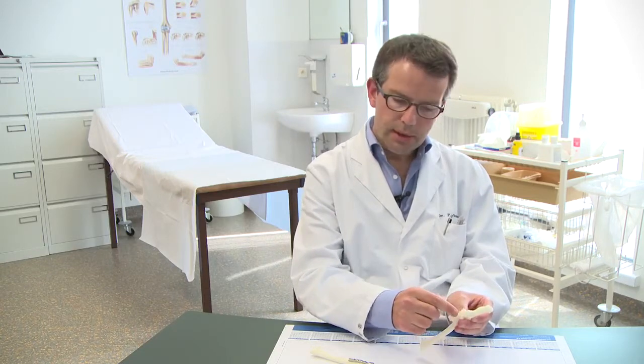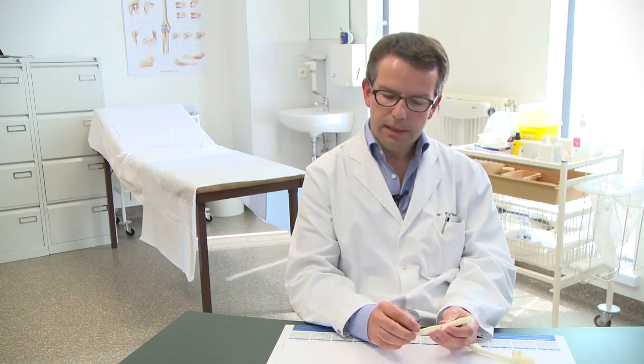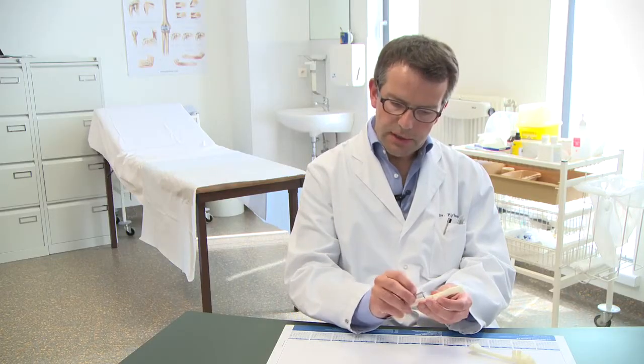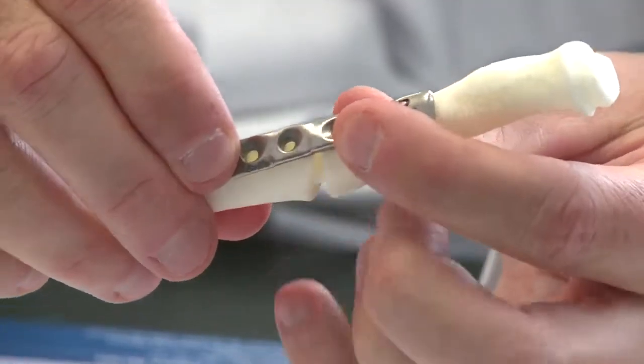The next step is to drill the holes and cut the bone through the guide. For Joos' arm, it was impossible to work with standard plates as the case was so complex. A custom plate was 3D printed in titanium and used to place the bones in the correct position. By putting the pegs in the pre-drilled holes, Dr. Verstreiken was able to automatically correct the rotation by turning the bone into the planned position, guaranteeing the result he wanted to obtain.